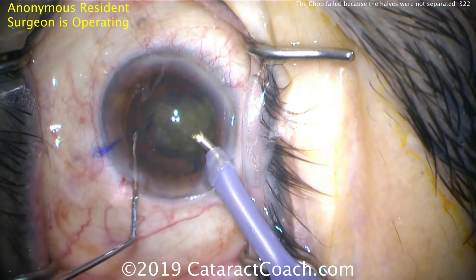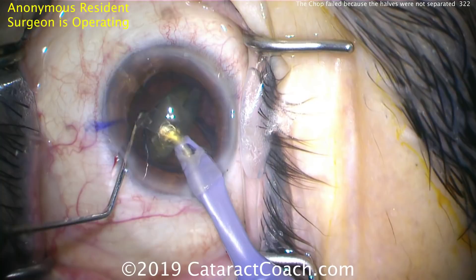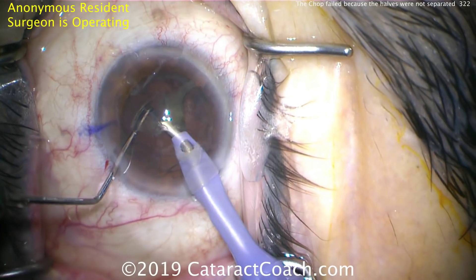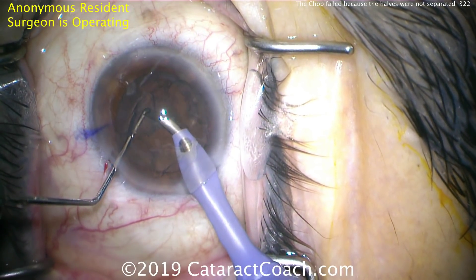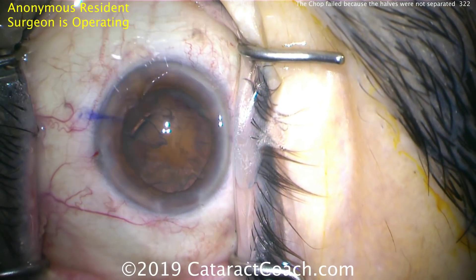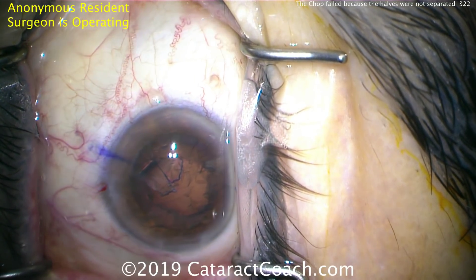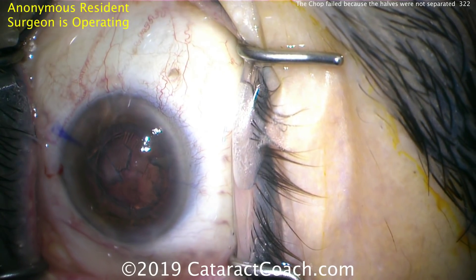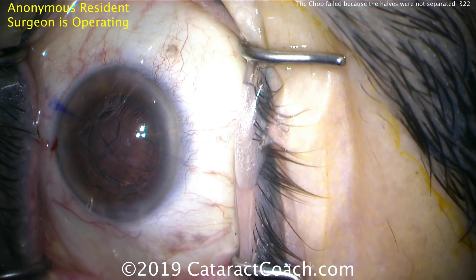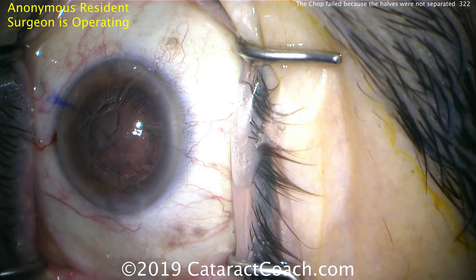If you didn't notice, it already happened — this is very subtle. The second half of the nucleus is being removed now, and the resident surgeon did not notice that the posterior capsule had been hit. During this nucleus removal it looks totally normal — everything looks okay. The breach is in the infranasal quadrant at the equator of the lens, so it's not very obvious. What will end up happening is this will pose an issue during irrigation and aspiration — I'll show you that video next.